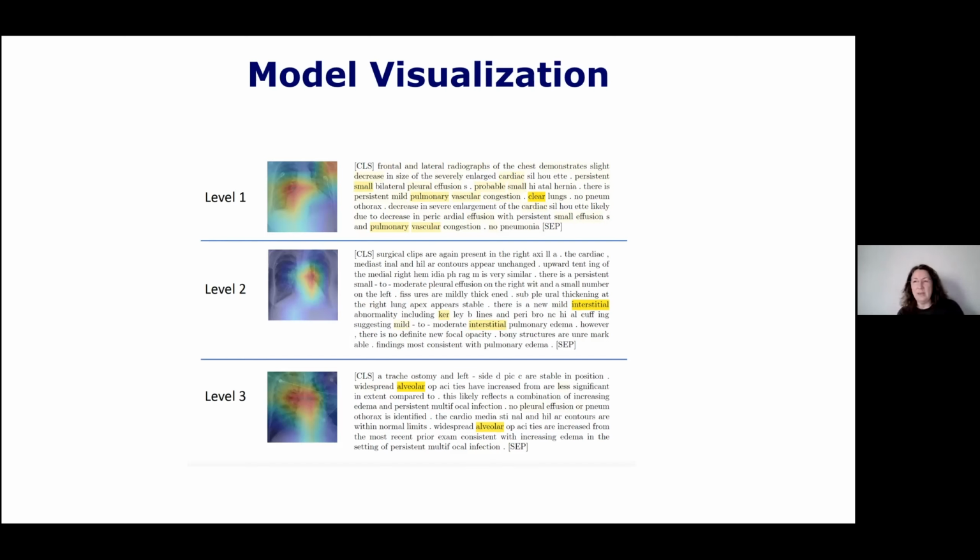Suppose I have a patient whose lungs are congested with fluid. If my classifier is doing its job right, then when I ask which part of the image was affecting the classifier the most, it should highlight the lungs. Now, suppose I have a patient who doesn't have any fluid in the lungs. What should this model highlight? Well, clearly the lungs, because to understand whether there is fluid in the lungs or not, it should look in the lungs.